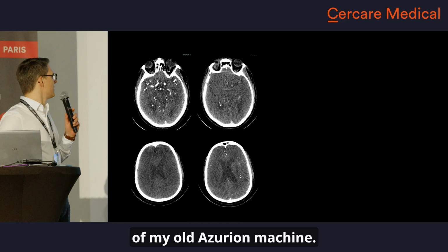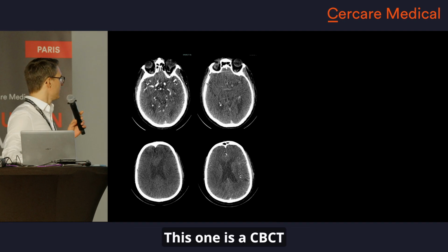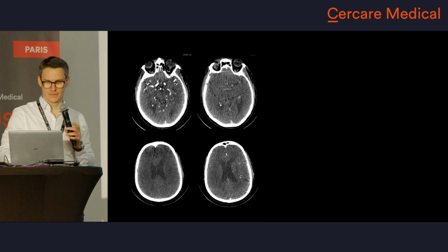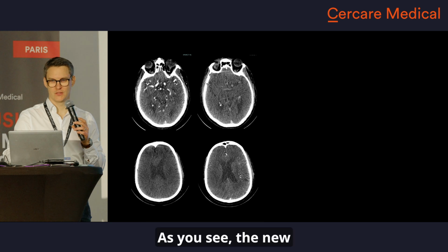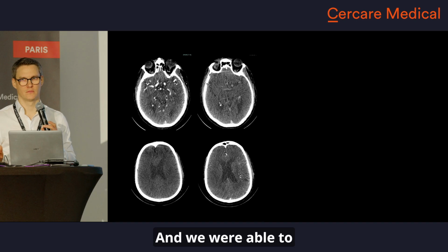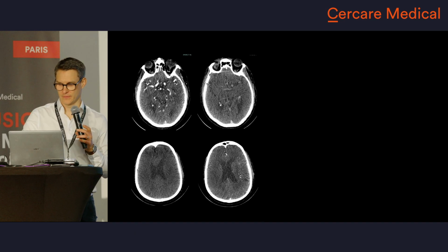Here you got some images of my old Azurion machine. We got 2 Azurion machines, one old and one brand new from 2 months ago. This one is a CBCT perfusion from the old machine. And here you got a scan from the new machine. As you see, the new machine provides a scan that is really comparable to CT now. And we were able to win 2 seconds per row, which is kind of good, but not enough actually.